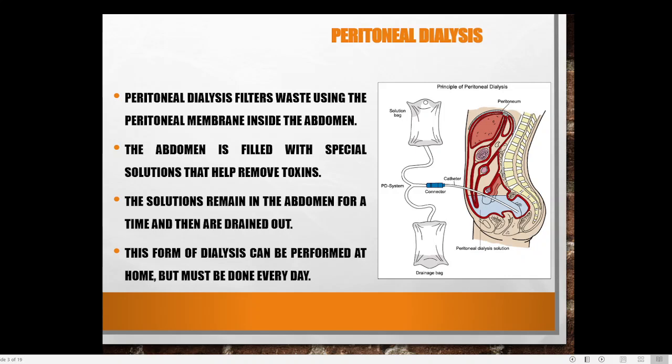So it's a very simple method of removing waste material, a crude method. We are pumping some fluid into the abdomen or into our stomach, and that will remain there for several hours. After that it will be removed, and while it is remaining in the abdomen, it will be taking whatever waste material or impurities are present in our blood into that solution, and finally that solution is removed.